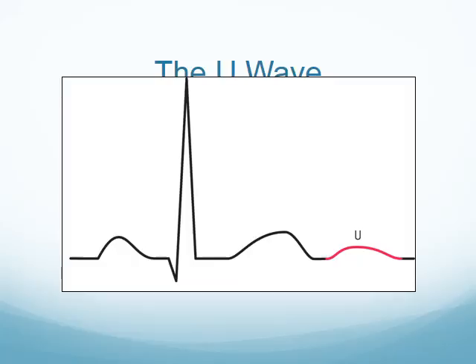As I previously mentioned, this is an example of a U wave. It's a wave that is sometimes seen. It usually occurs in the same direction or deflection as the T wave. Not seen very often. There are some drugs that can cause U waves. Sometimes you can see it in patients that are taking digoxin or Lanoxin, but it's very uncommon to see. And like I discussed at an earlier time, the U wave is of unknown origin. They don't know what really causes it.